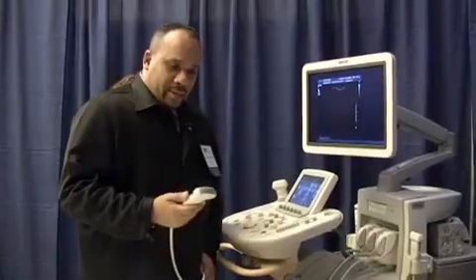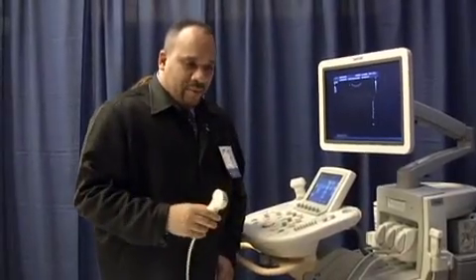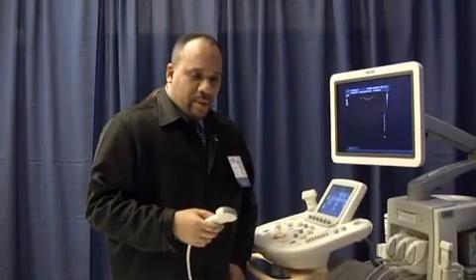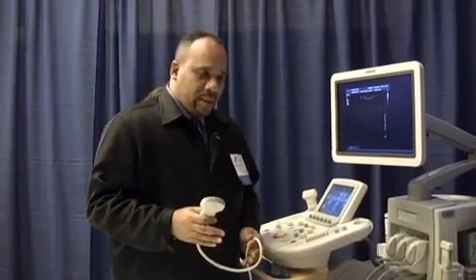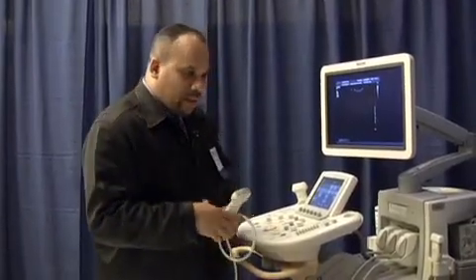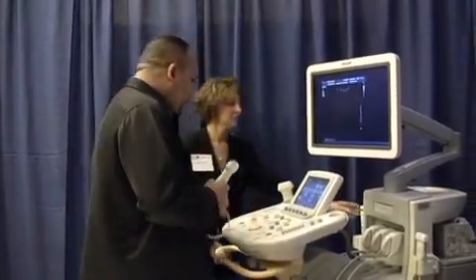So we're going to start out today at the level of the aorta. I'm using a curved 5-1 transducer. Although not every examination starts at the level of the aortic bifurcation, for the purposes of this demonstration, I'll start here and then I'll elaborate as we move along.